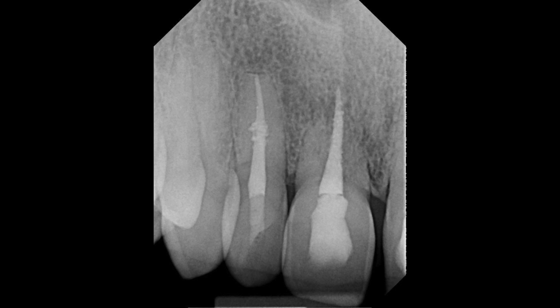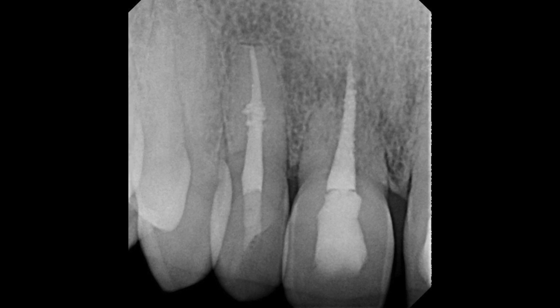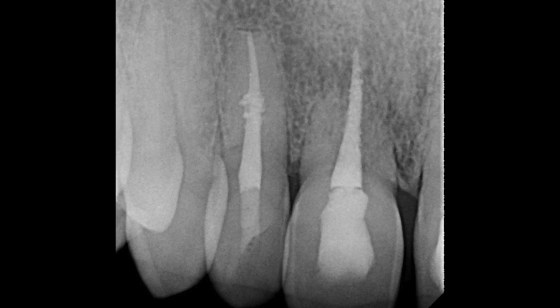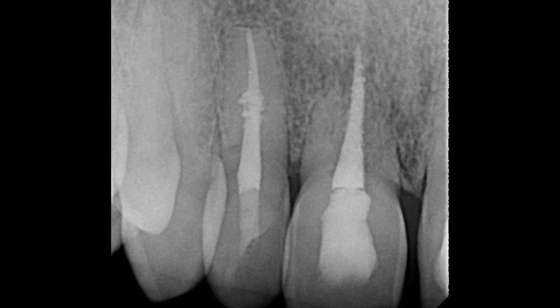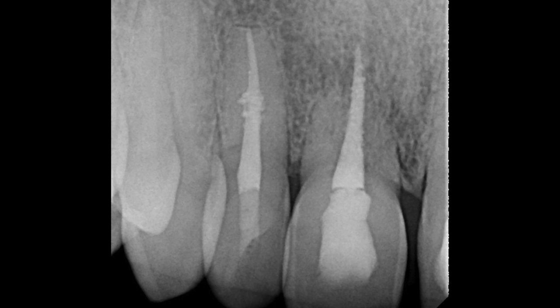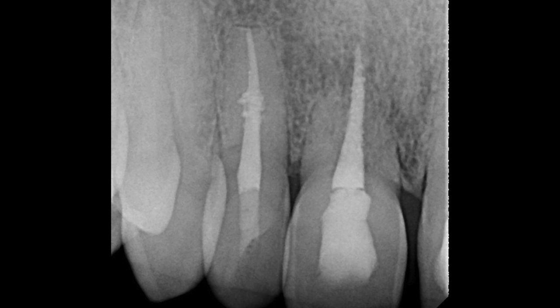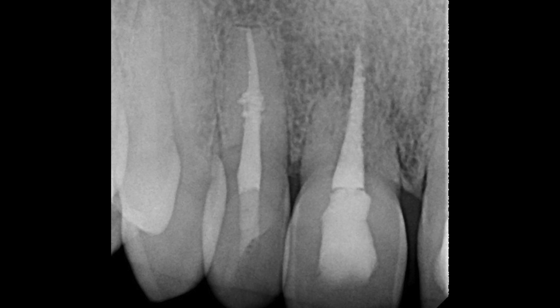The canal has been filled adequately, and even the resorptive lesion has been filled with sealer expressed via hydraulic condensation, with lateral pressures exerted by the cone filling that area. The patient was followed up about a month and a half following treatment — no symptoms, no probing, no buccal palpation sensitivity, and no percussion sensitivity. The tooth has been healing very well. I'll have the patient return to their restorative dentist to remove a couple of millimeters of core material surface and place a smooth, polishable aesthetic composite restoration in the access opening.